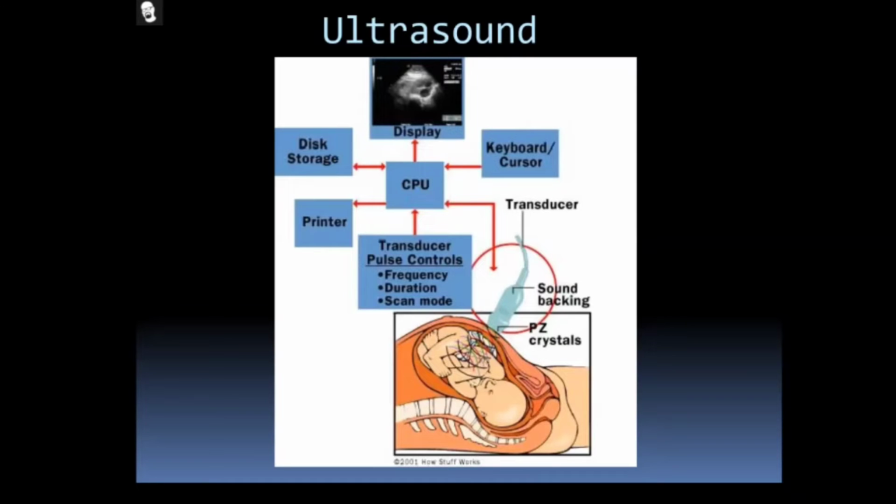Most importantly, for example, if we go for X-ray, CT, MRI, they can't give the real-time image. That is a very important thing. Even though you can use MRI and CT, we can get only the three-dimensional image. The real-time moving image, the real video, we can see using this particular ultrasound. Rather than going for a still image, we can acquire the real-time video through this ultrasound machine. That is the extra advantage we have.